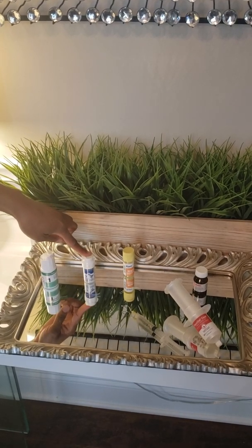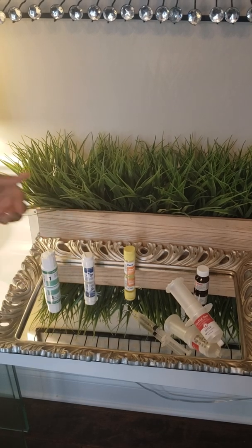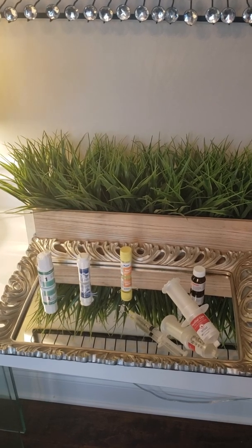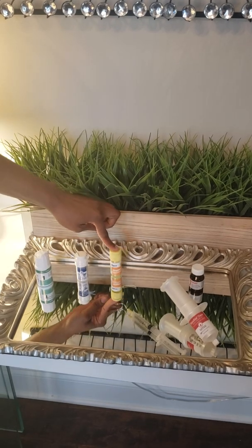This one is a knitted cord, and you can see it's a little bit different in the size and also the color of it. It's just a matter of preference. I believe with this particular company, they use different colors to promote different sizes, which is a good thing as well. This last cord is also a braided cord.